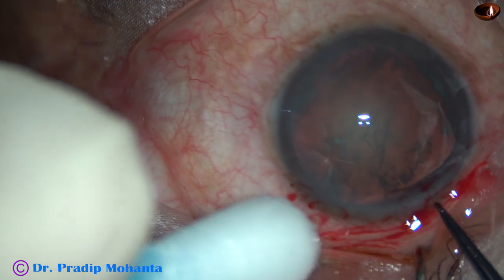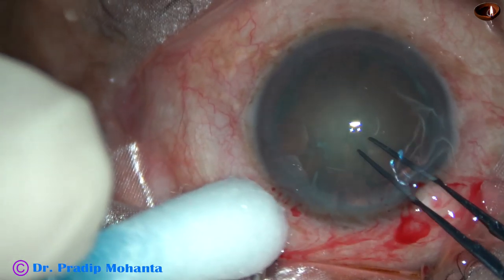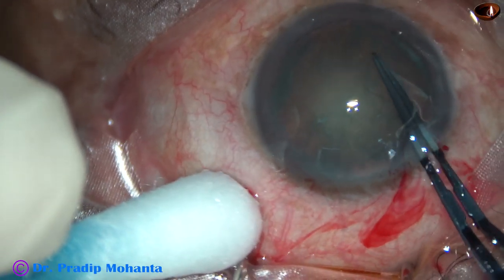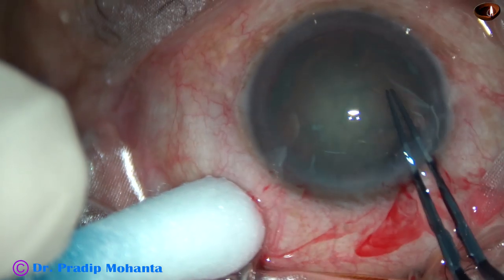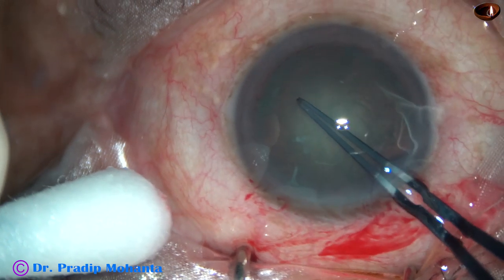A capsular tag is raised. Now I hold this capsular tag with the utrata forceps going anti-clockwise, and do a rhexis of adequate size, about 5.5 mm.